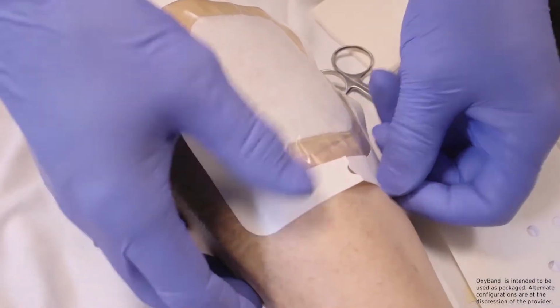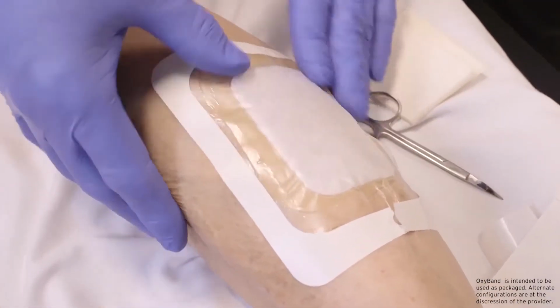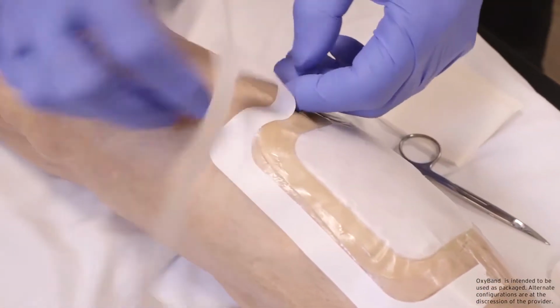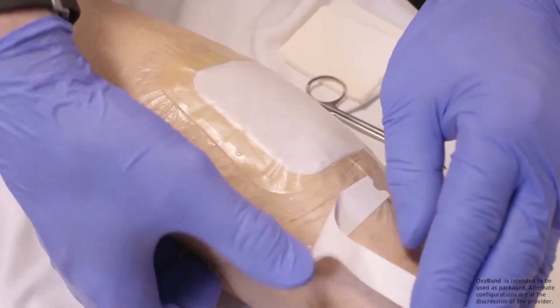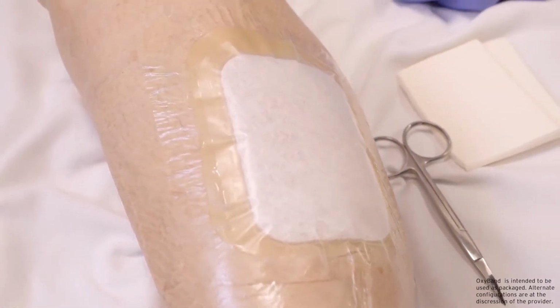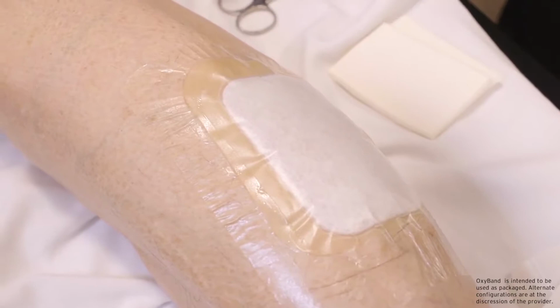And that is accomplished to seal the oxygen inside the dressing so that it penetrates directly to the wound. We can then remove the tabs from the Tegaderm type of material, again sealing that dressing all the way around. We have created a seal over the wound. The reservoir is now activated, delivering oxygen to the wound base through that entry port that we created in the hydrocolloid dressing. I would now like to demonstrate application of the OxyBand dressing on a wound that has more exudate.